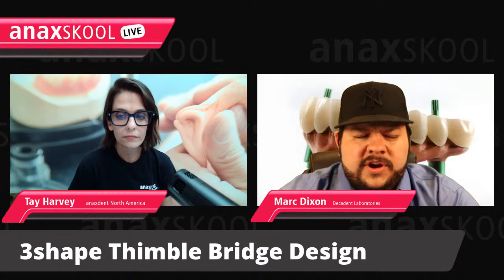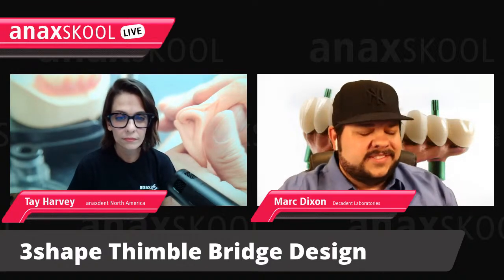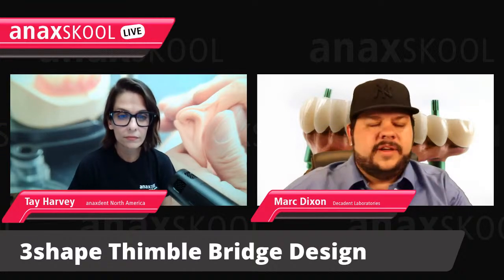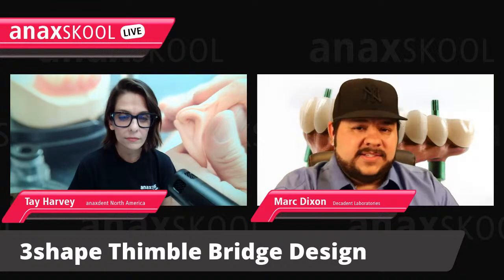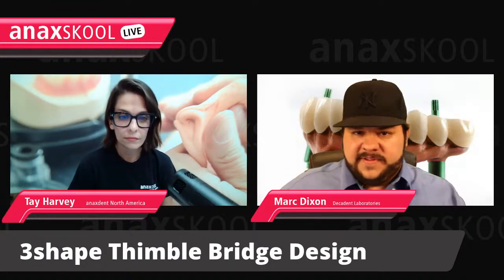So you're going to design a full mouth. I'm pretty sure that maybe the doctor wants some screen captures. Maybe the patient wants to see it. Maybe somebody's going to log in on TeamViewer and take a look. So you're going to design the whole thing. You're going to close the case. You're going to open it again, right? But the problem with that is you don't do everything exactly the same as you did the first time. And this could be a 4-hour design process from start to finish.